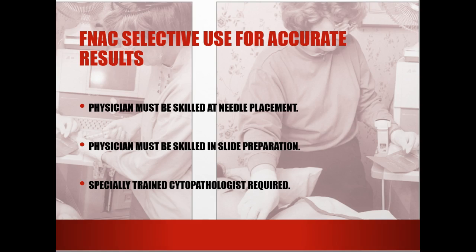The one that we were using at Dignity Health is called a Faxitron, and it's a little clip that gives off the signal, and you have the little receiving devices in both the OR and in the mammography department, and you can also see them on your x-rays.